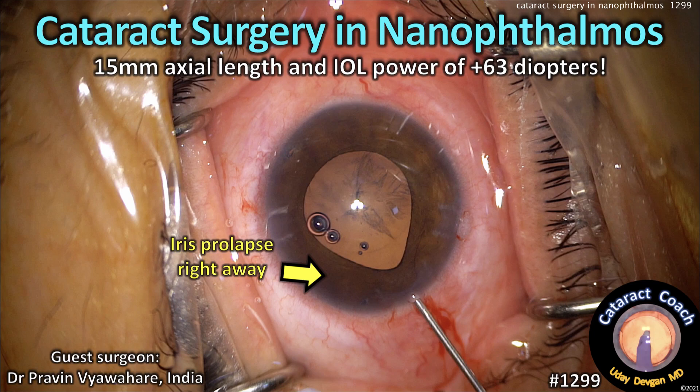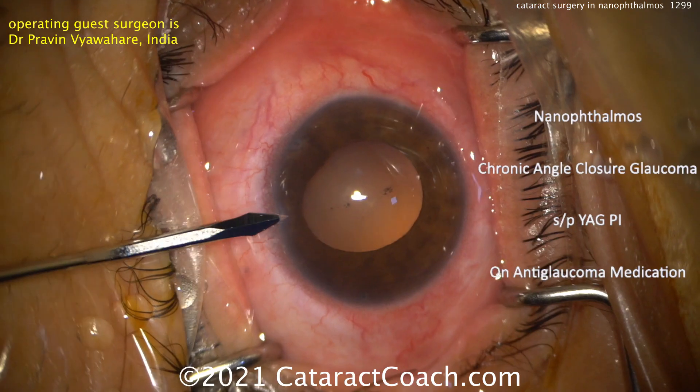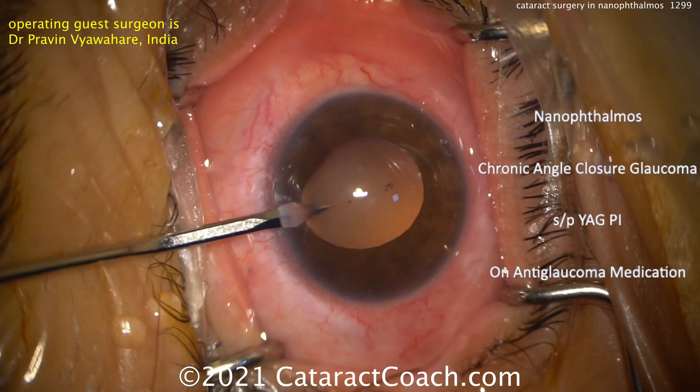CataractCoach.com - Cataract Surgery and Nanophthalmos. This patient has a 15mm axial length and an eye power of 63 diopters. Our guest surgeon is Dr. Praveen Vyawadeh from India. You can see those tiny eyes — this patient has Nanophthalmos.